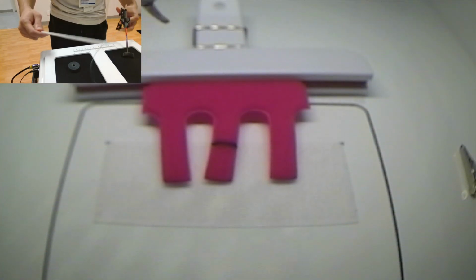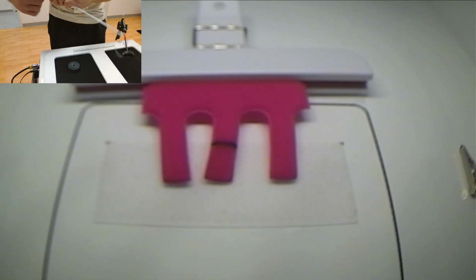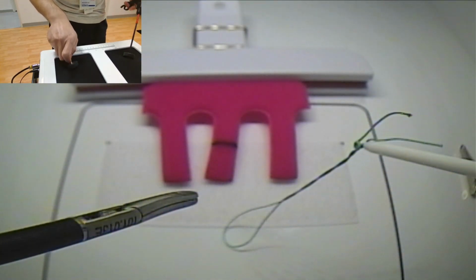But the first thing you do once you have the loop here and time begins is actually snap it, and you bring the loop in to make it smaller and more manageable while wrapping this around your finger so you have better control over pulling it back. So you bring the loop in over here.